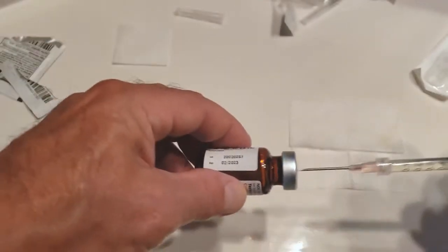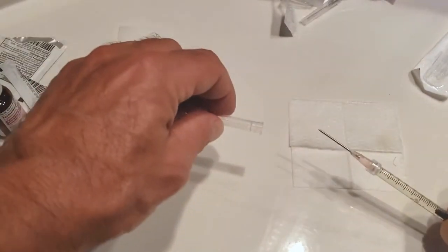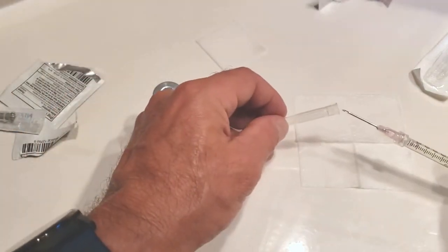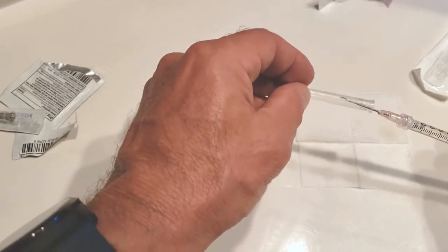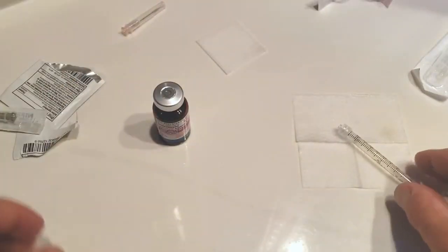Remove the syringe from the bottle and set it down. Cap the syringe — there's a tip about capping: some people miss and stab themselves. If you just set the cap on the needle and tilt it up and let it fall down, then safely secure and twist it off. Set that back down on the sterile field.